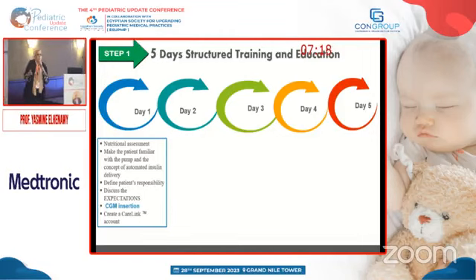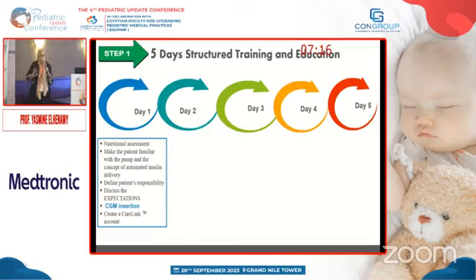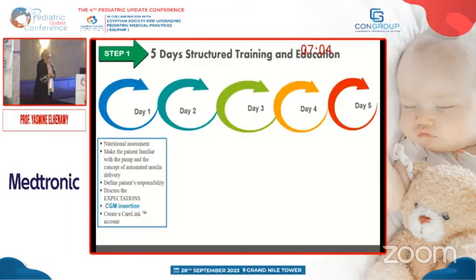والاكسبكتيشن من السيستم علشان هو بيبقى فاهم اول ما احطها انا هوصل لتارجت رين 100%. It is very important يعرف الاكسبكتيشنز والريسبونسابيلتيز بتاعته from day 1. بنركب سي جي ام، بنركب سنسور من day 1 وبنعمل كيرلينج اكاونت.